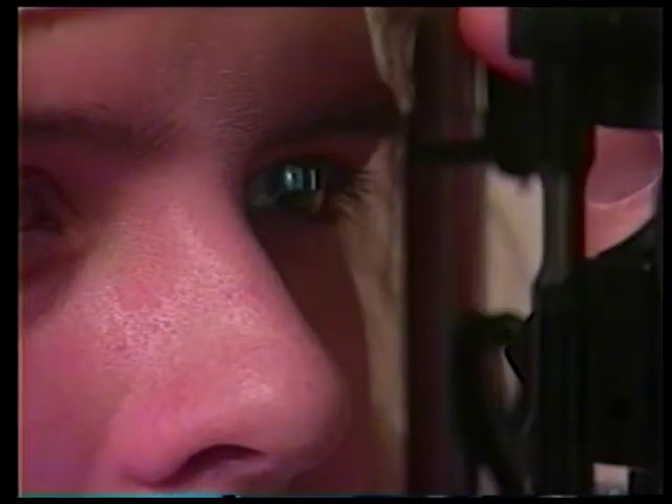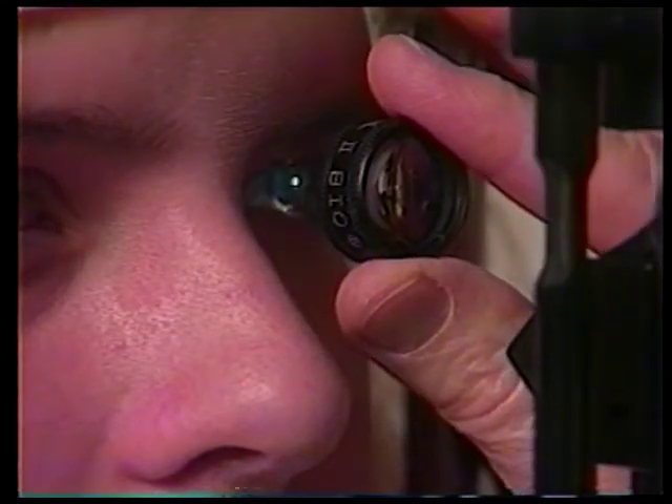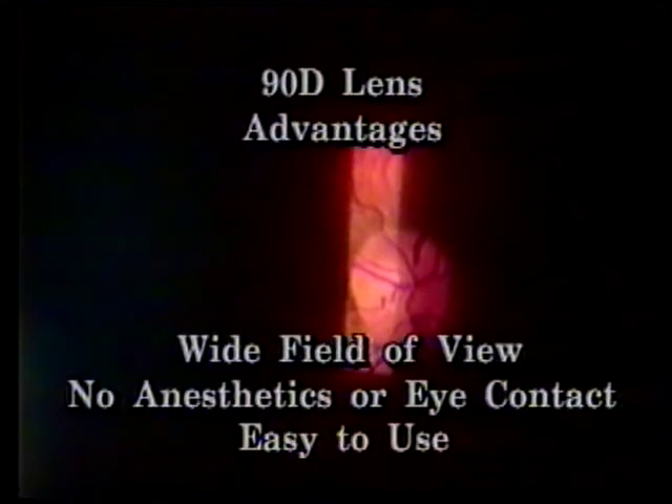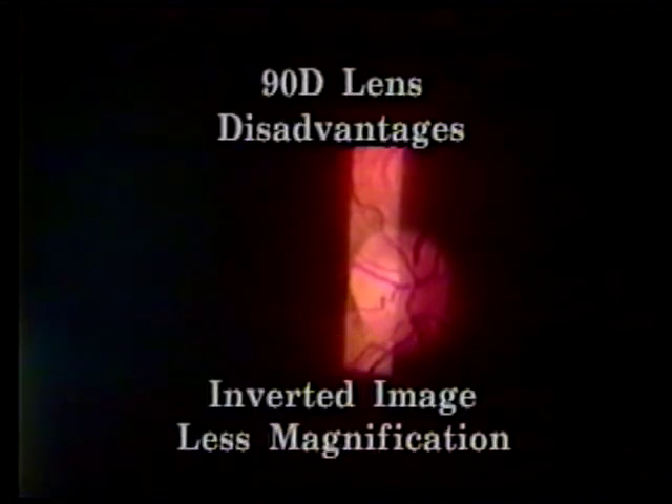Maneuver the lens and slit lamp for the best view to reduce reflections and to evaluate various areas of the posterior pole and some peripheral retina. The 90-diopter lens produces an inverted and reversed image, just like indirect ophthalmoscopy. Its advantages are its wide field of view, avoidance of anesthetics and eye contact, and the general ease in using it. The inverted image and smaller magnification are considered by some to be its major faults.